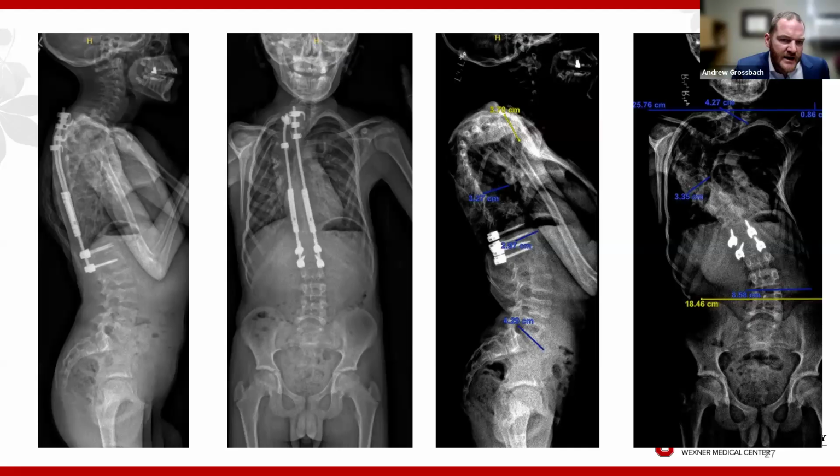So initially, he had some growing rods placed for his scoliosis. You can see those on the left, the sagittal and the AP X-rays. Those are taken out, and you can see what happened. So he kyphoses over, and you can see his upper thoracic scoliosis is pretty terrible on the right there.